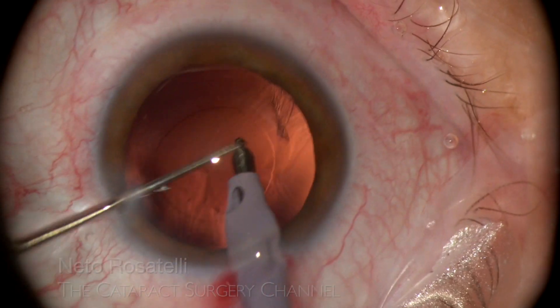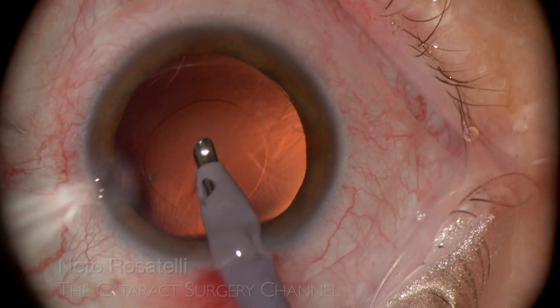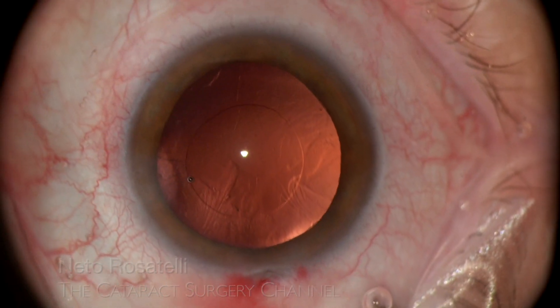There is just a small cortex remnant left and it is readily aspirated with the phaco tip, with the chopper protecting the posterior capsule.